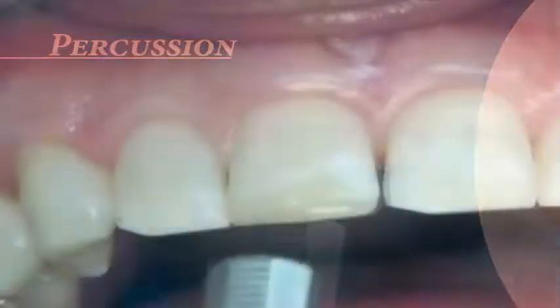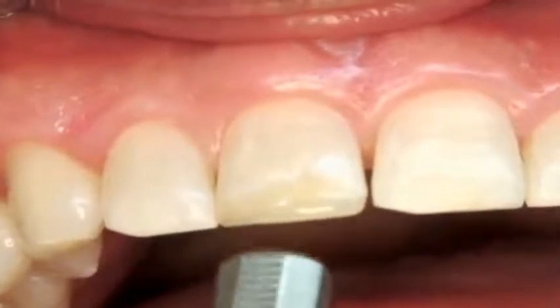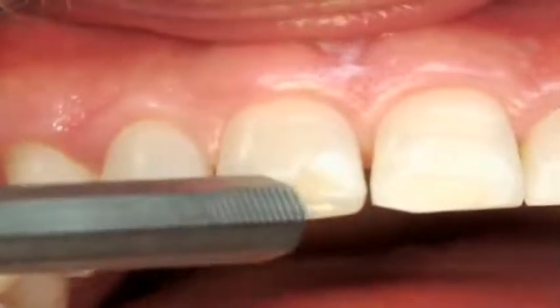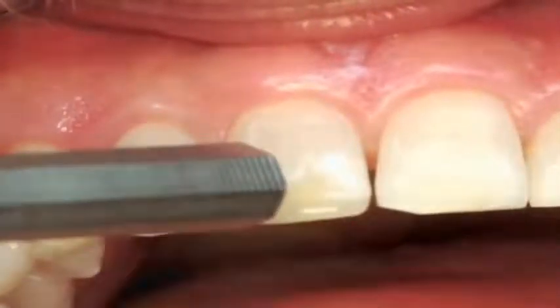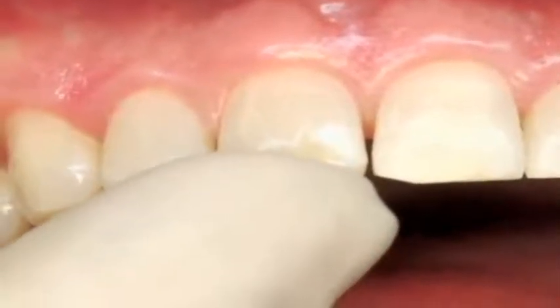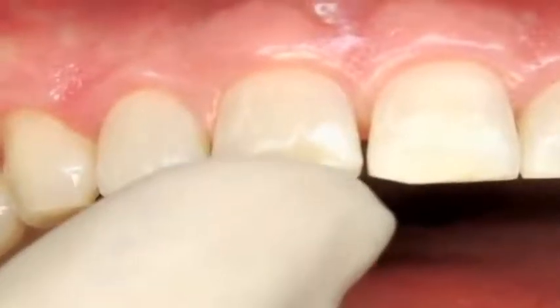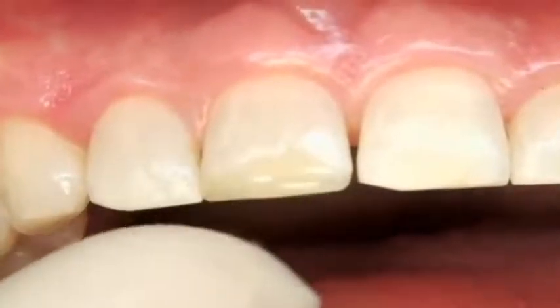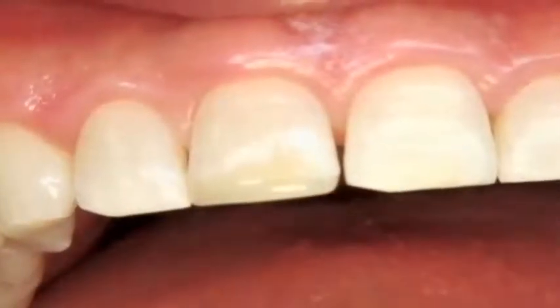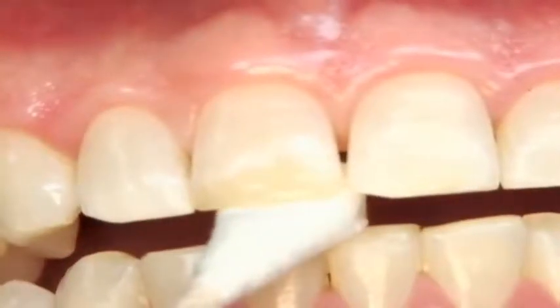Percussion is performed by tapping on the incisal or occlusal surface of a tooth with the end of a mirror handle held either parallel or perpendicular to the crown. This test should be preceded by gentle digital pressure to detect teeth which are very tender and which should not be tapped with the mirror handle. An additional approach is the biting test. For this test, the patient bites down on a cotton swab.